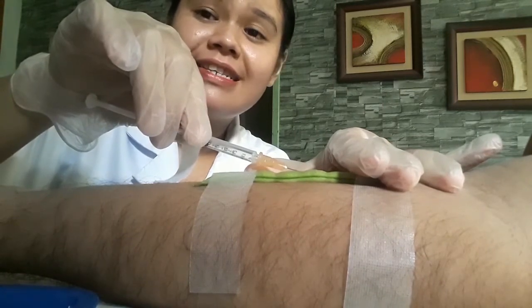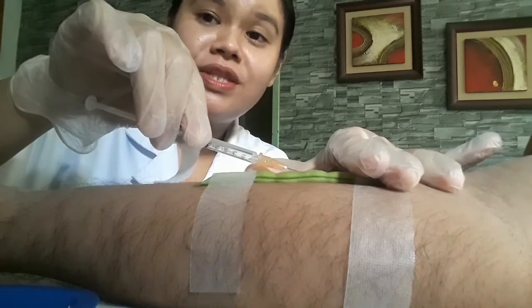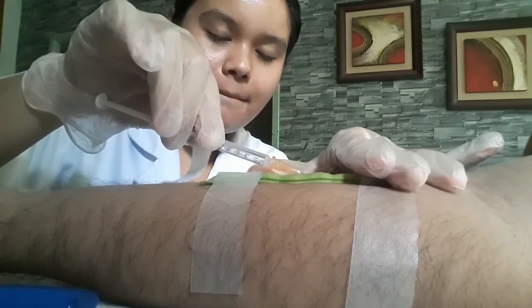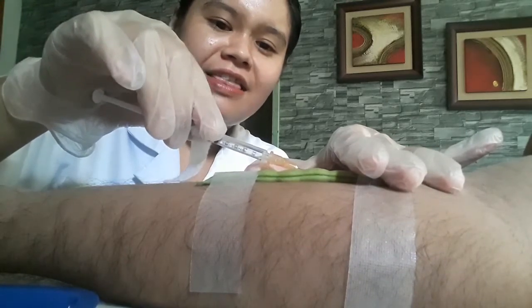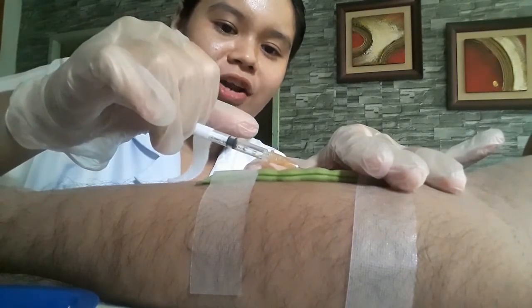If you feel resistance, advance the needle until it is into the epidermis at 1/8 inch. After that, release or inject the medication.